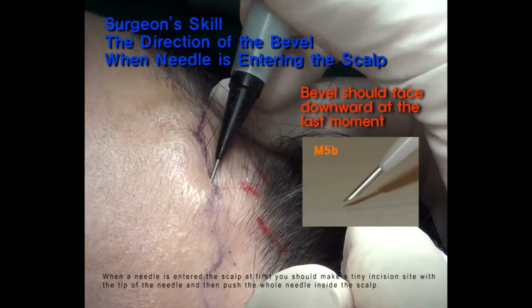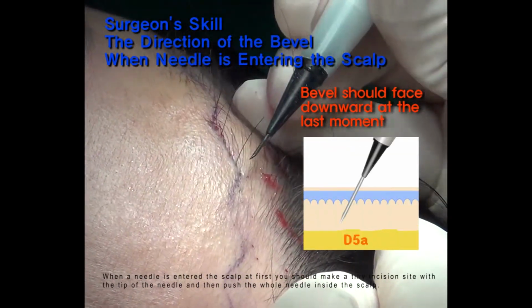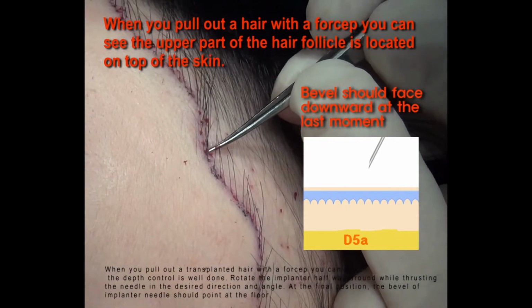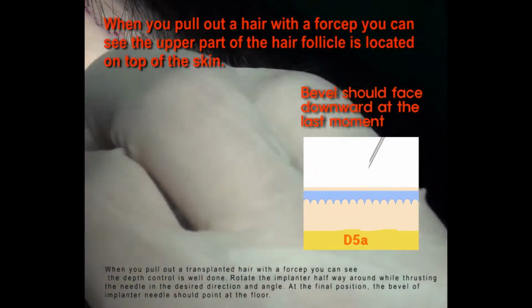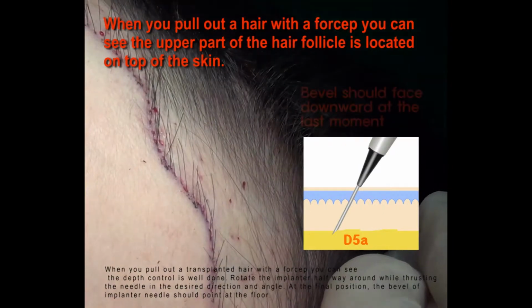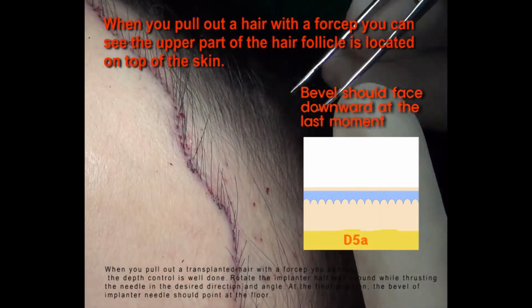When a needle enters the scalp at first, you should make a tiny incision with the tip of the needle and then push the whole needle inside the scalp. When you pull out a transplanted hair with the forceps, you can see the depth control is well done. Rotate the implanter halfway around while thrusting the needle in the desired direction and angle. At the final position, the bevel of the implanter needle should point at the floor.